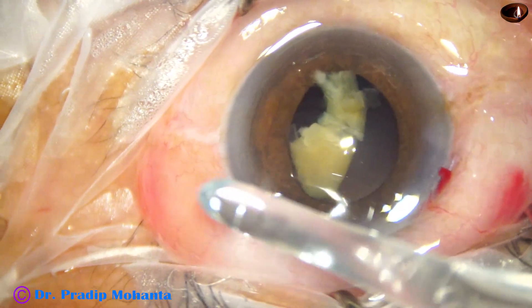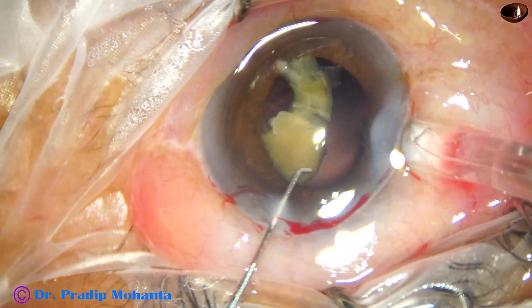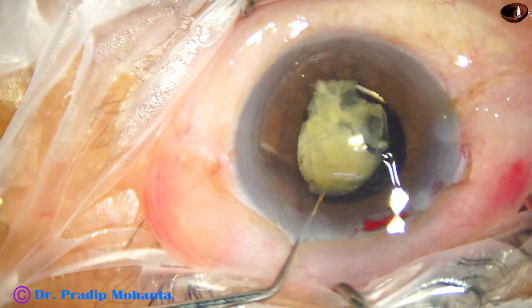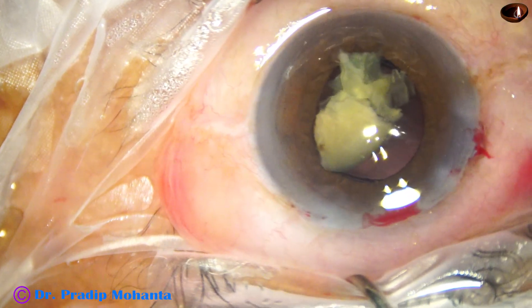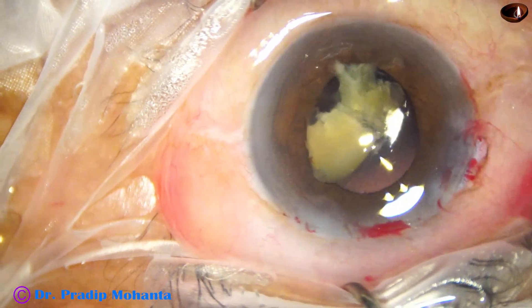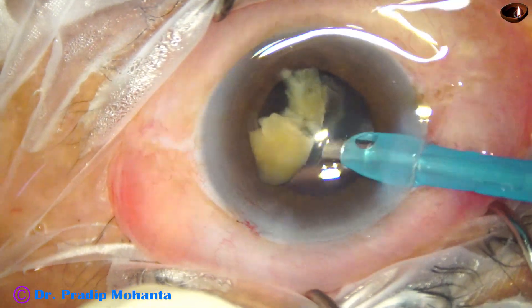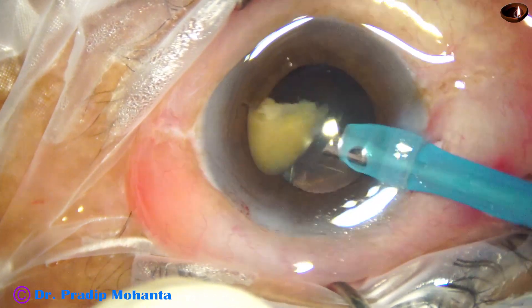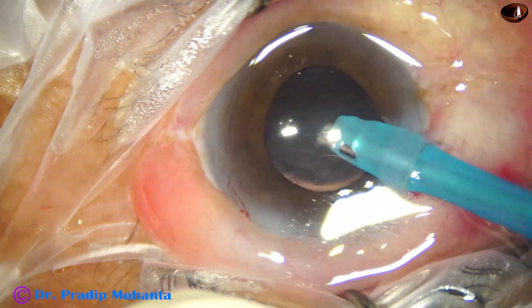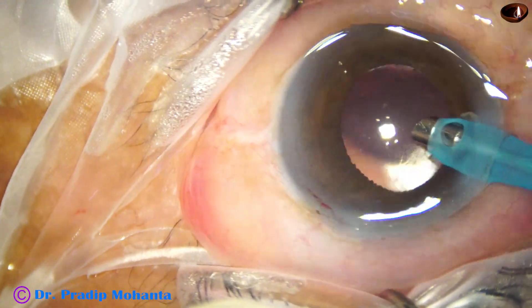Placing the lens — a hydrophobic single-piece acrylic hydrophobic lens in the capsular bag. This lens will protect the posterior capsule 100%, because no portion of the posterior capsule will come in contact with the phaco tip now. The only precaution at this time is that the phaco tip will be at the iris plane and it should not touch the anterior surface of the intraocular lens. The remaining cataract is emulsified slowly without touching the anterior surface of the IOL and remaining far away from the corneal endothelium.